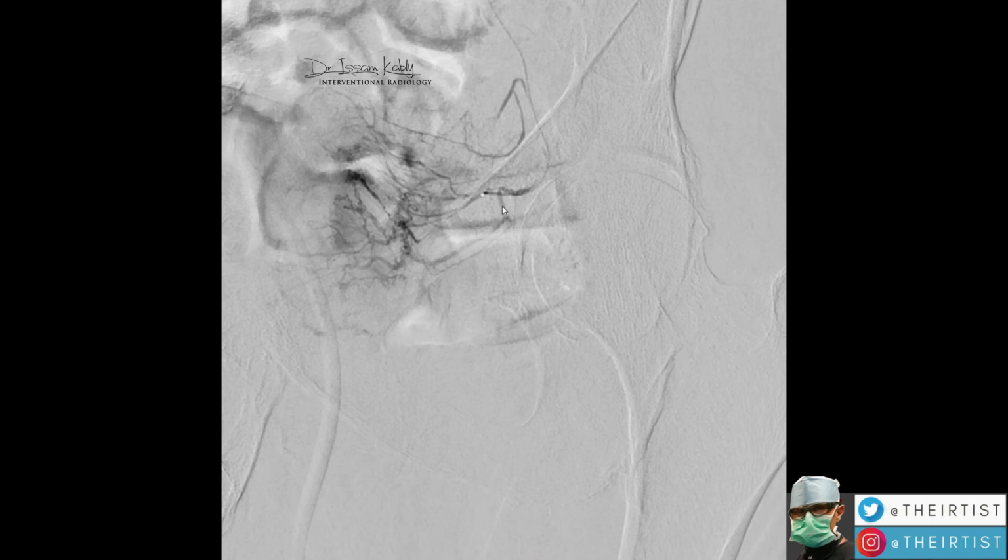So you see this artery here coming on the side. This is not an artery I'm interested in embolizing because it goes mainly to the periphery of the prostate. If you look above, there is another artery that may go to the bladder. So that's why it's important to do this type of procedure with a physician who is an expert, who has done this procedure, because if God forbid they make a mistake and embolize these tiny vessels, that may lead to a problem with the bladder.